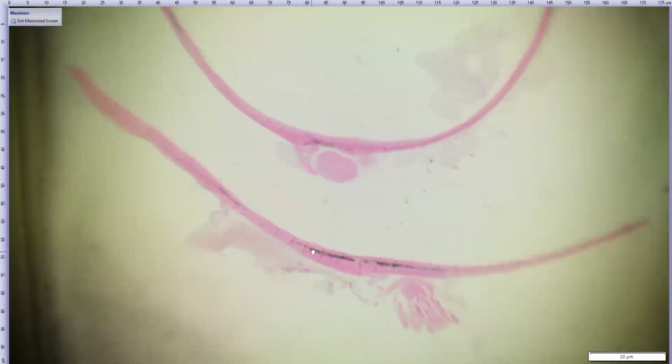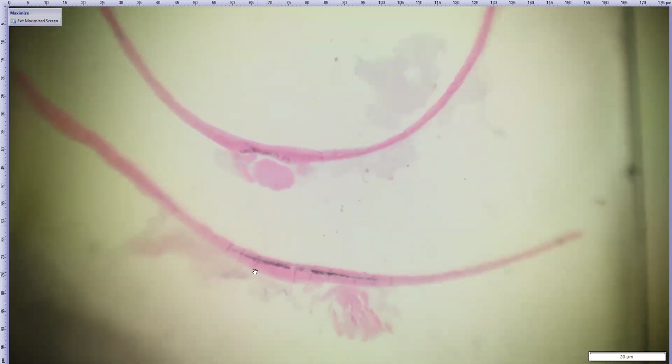Here is our optic nerve back here. And here's just another little extra radial section here. We do see a little bit of pigment still left here, and we'll take a closer look at some of these features here.